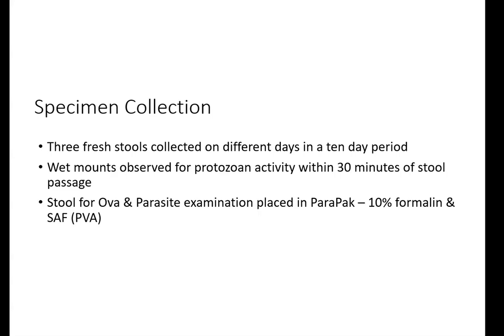The SAF or PVA is polyvinyl alcohol. SAF, but it's a safer alternative to some of the other, like using the PVA or formalin. I'm looking, where's SAF? Can't find it anywhere. Sodium acetate acetic acid formalin. Okay.